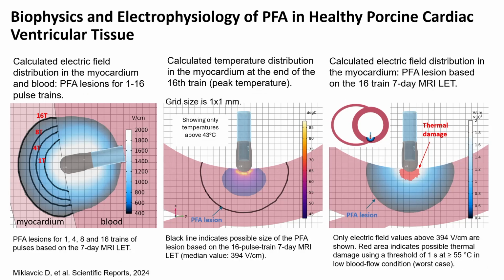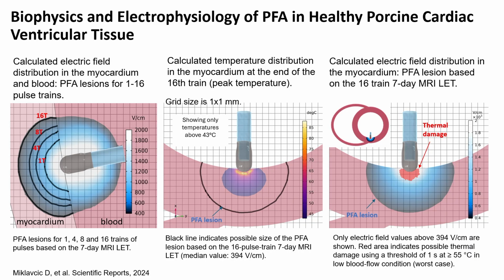We published on December 30 a paper where we did the ventricular ablation. We were limited by the technology, so we used a non-optimized catheter and a non-optimized waveform. The only thing we could do was change the voltage, which is a lot. Many people can't do that. And we did deliver a number of pulses. Of course, we also looked at the lesion size, both by cardiac MRI, but also on the gross pathology and histology. And these are basically the results.